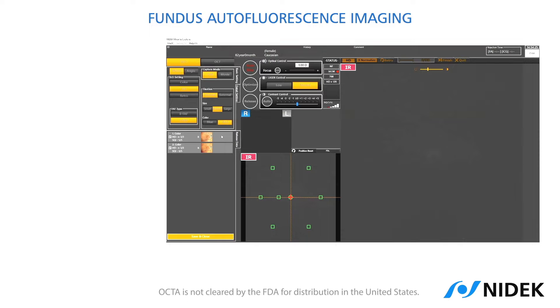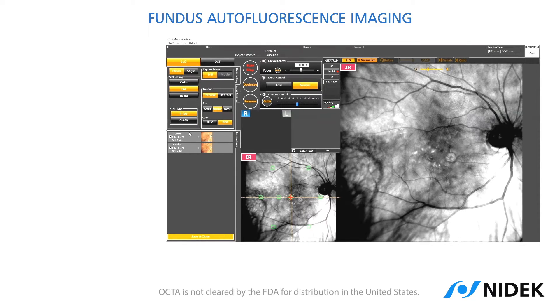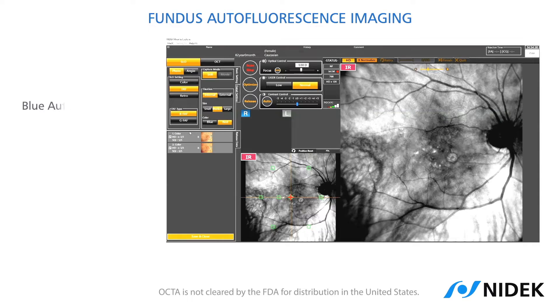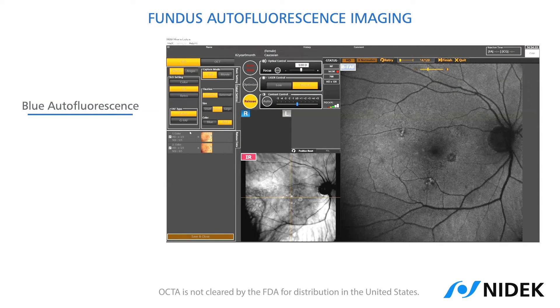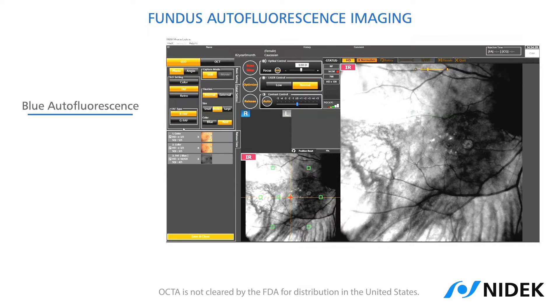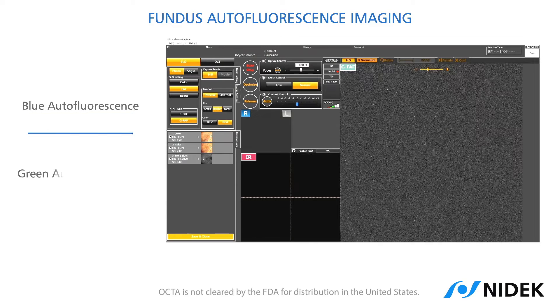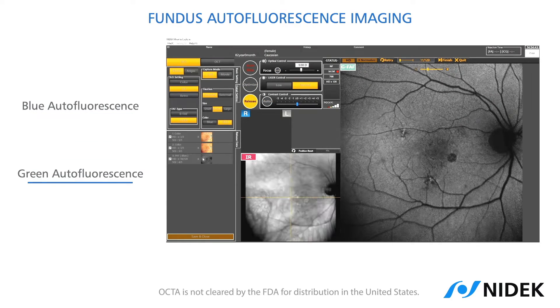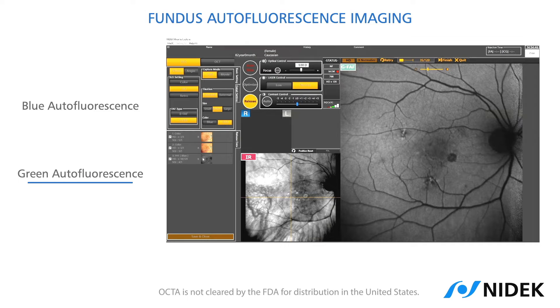The same procedure applies when you want to capture fundus autofluorescence images with either blue light, which is the most common form of autofluorescence, or with green light, to minimize the absorption effect due to macular pigment in the foveal area.